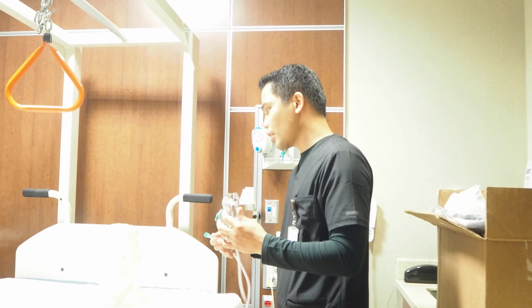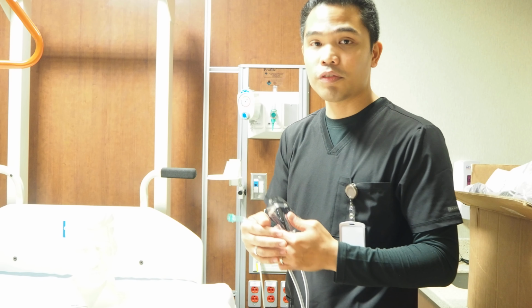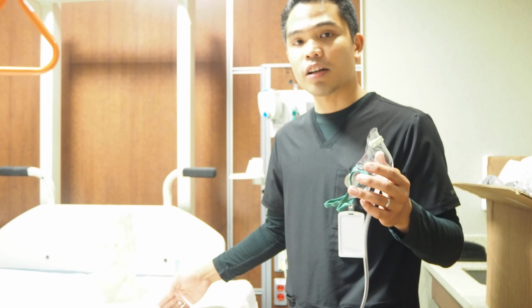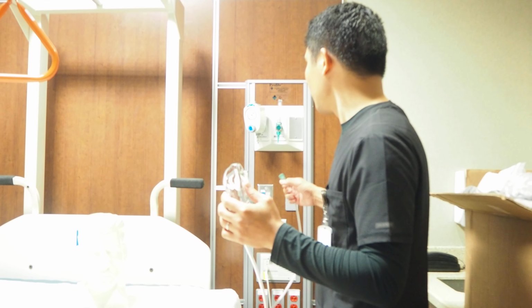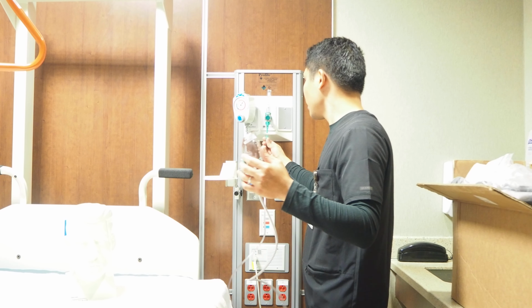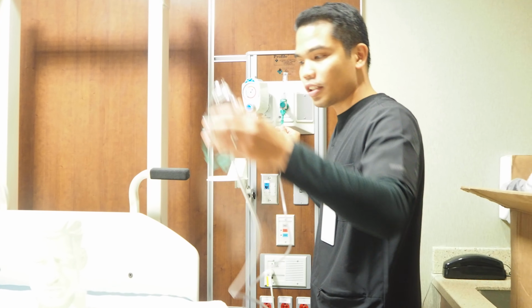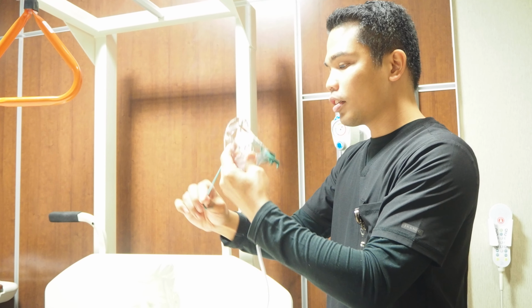So of course before that, I always make sure that I'm able to obtain any pertinent information, and at the same time, of course, I have to do a set of vital signs and patient assessment to the patient. So before that, I have here a simple mask, and it was being ordered because the doctor insisted to be hooked up with a simple mask. So I just immediately put this simple mask on the patient.